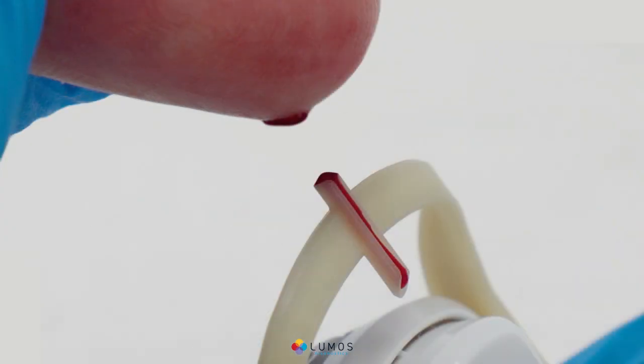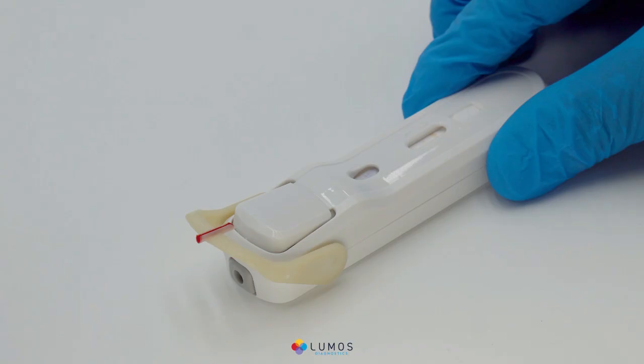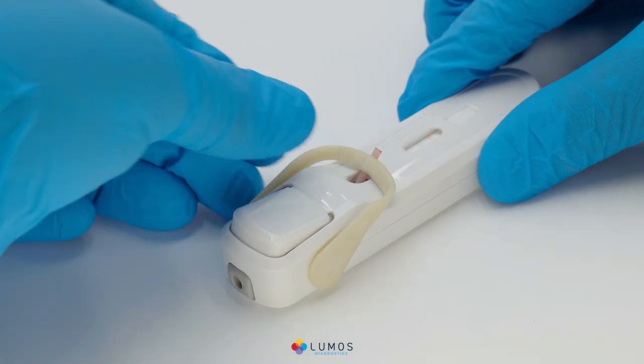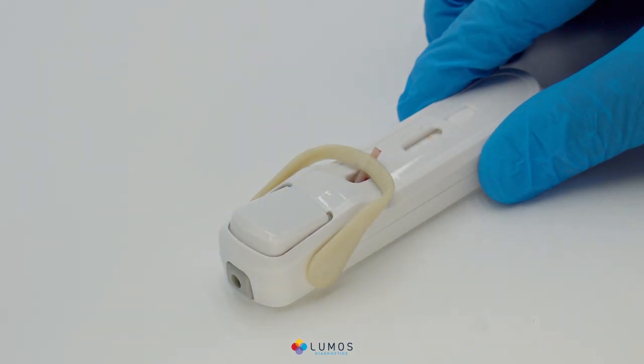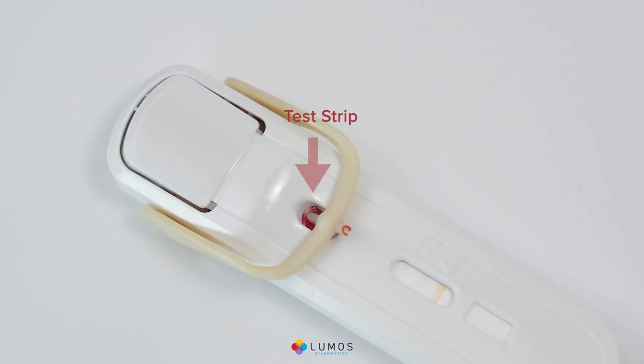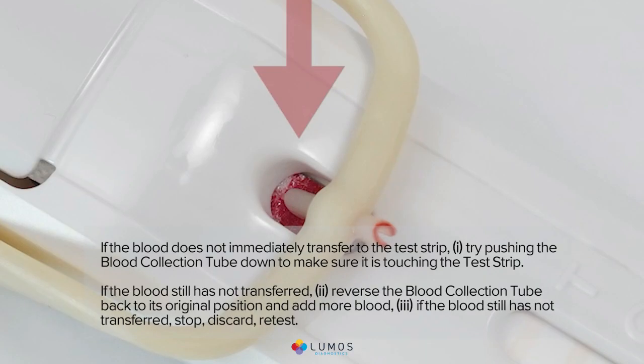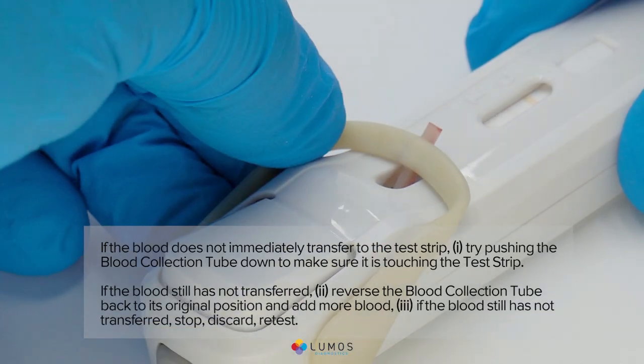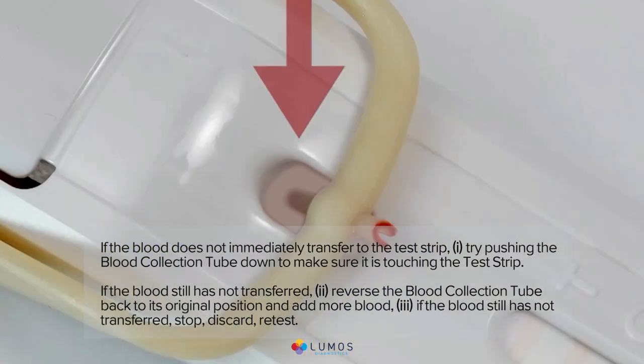Once the blood collection tube is completely full, lay the test on a flat surface. Rotate the blood collection tube to touch the test strip — you will hear a click. Make sure the blood has been transferred to the test strip; blood should be visible on the test strip. If the blood does not immediately transfer, try pushing the blood collection tube down to make sure it is touching the test strip.